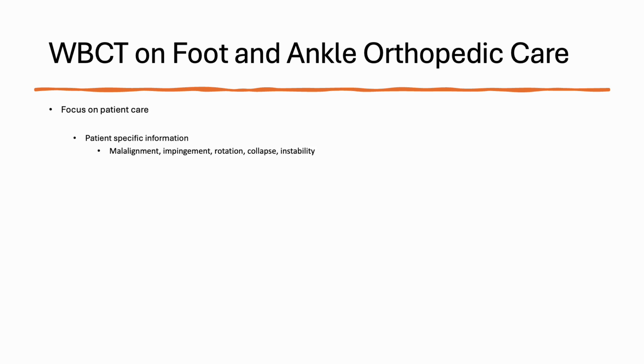So what does a weight-bearing CT scan in foot and orthopedic care mean? It's a focus on patient care. So we're going to get patient-specific information. PSI, we hear that a lot, usually in deformities and total ankles, but you can do this for anything at this point in time, and I think it will be shown to be a really great way of advancing care.